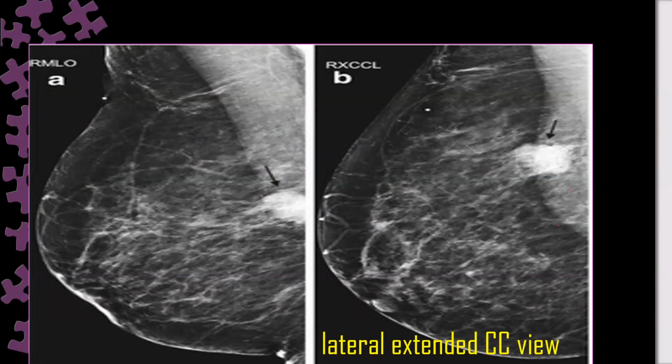I know the exaggerated CC from the exaggerated MLO, but honestly the second image, the last case, I thought it was a lateral MLO. Yeah, that is why I explain. Why do I say that? Because the nipple is coming lower down here, and these projections of the breast look more or less the same as the MLO and the pectoralis muscle here. Okay?